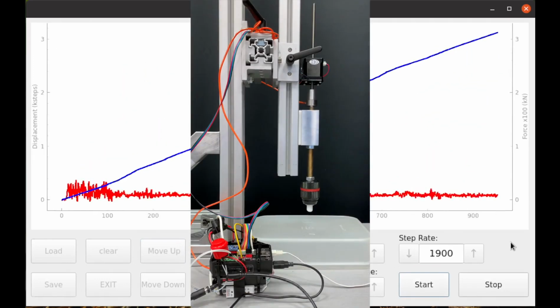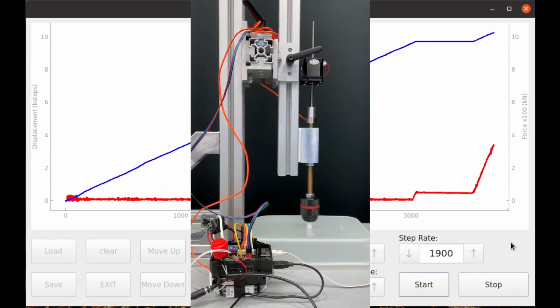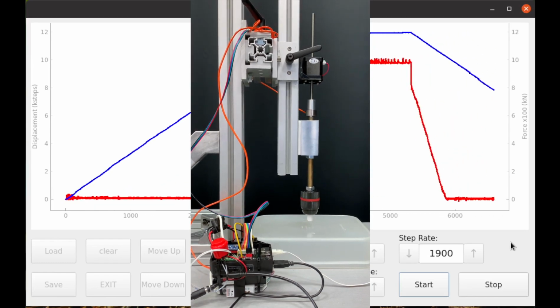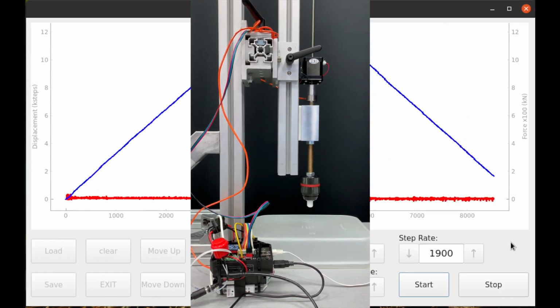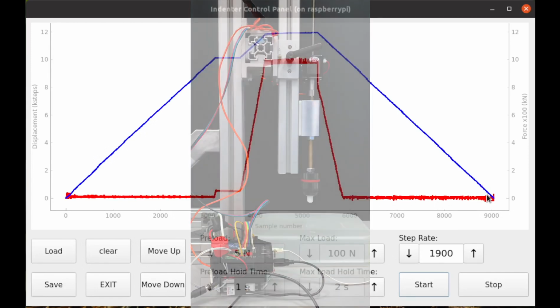As we see, data starts being collected from the load cell and we start measuring the displacement of the stepper motor. After a brief period of the preload time, we start moving up to apply our maximum load. Our maximum load is then held for our given period of time and the indenter head is retracted. All while this is happening, we continue to record our data.